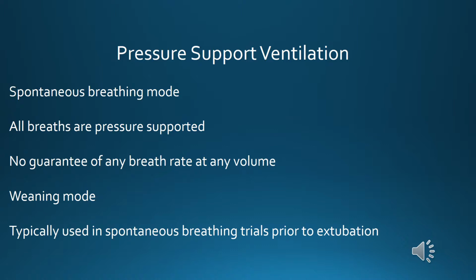In pressure support ventilation, there's no guarantee of any breath rate, and there's no guarantee of any volume. It is typically used as a weaning mode, and this is typically used for spontaneous breathing trials just before extubation.